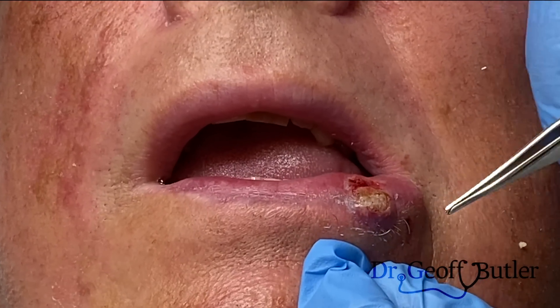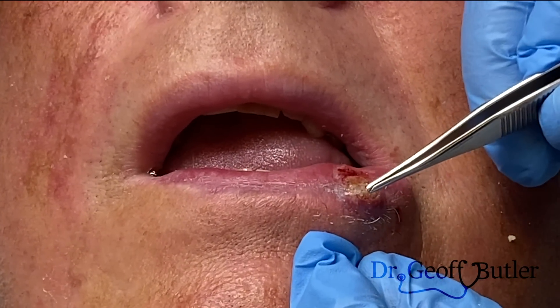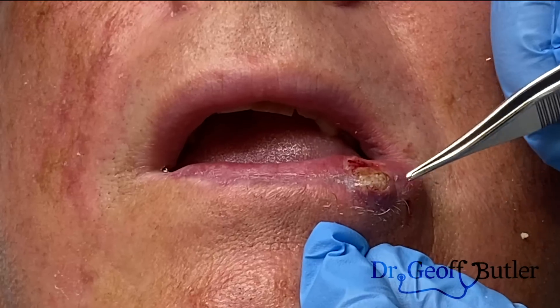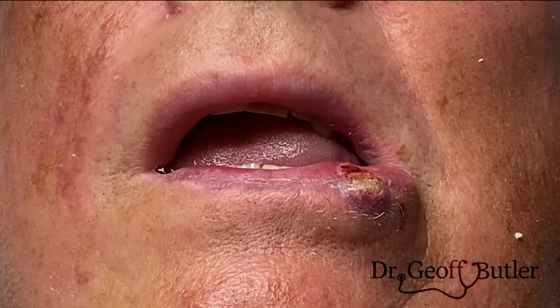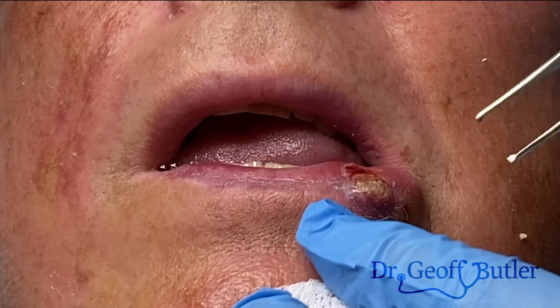But we have to sort of work within that system. So I've frozen around through here. Despite the fact that this is on the vermilion border, I'm going to do a shave biopsy. As long as I cauterize it and I don't take the tissue out, we should still retain the symmetry along that actual border.